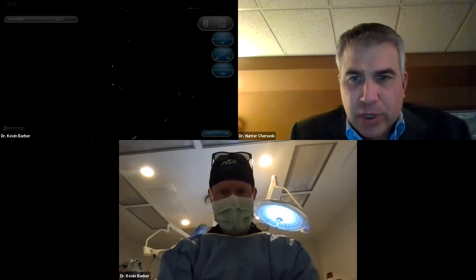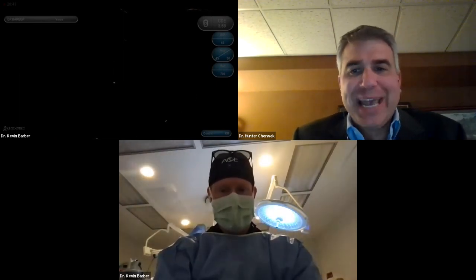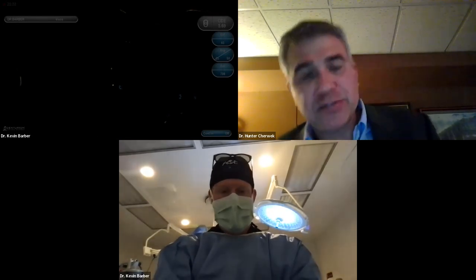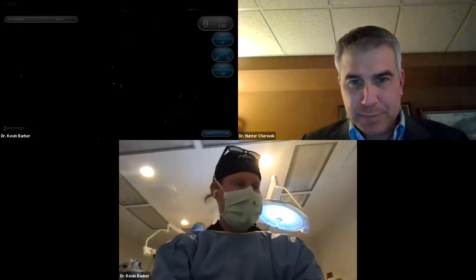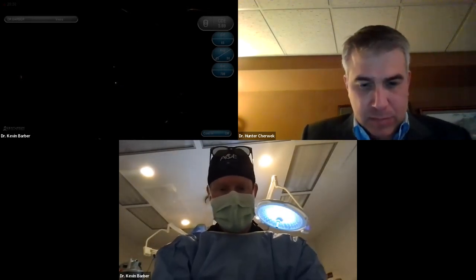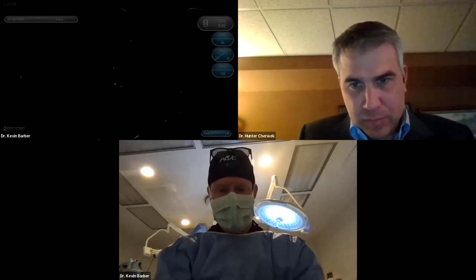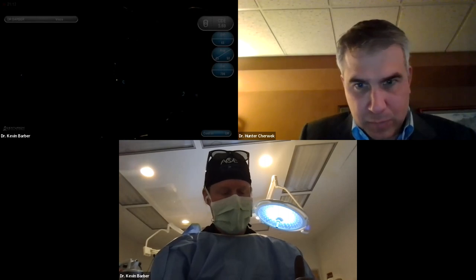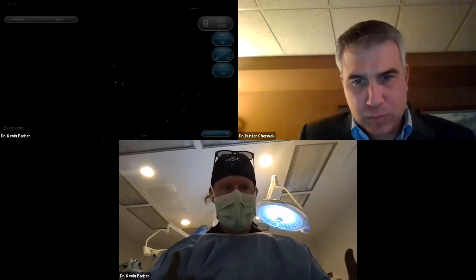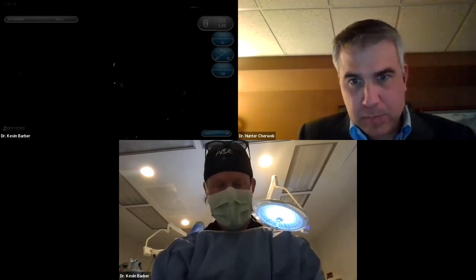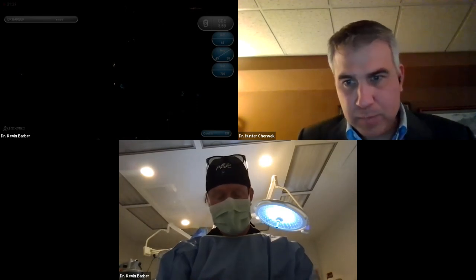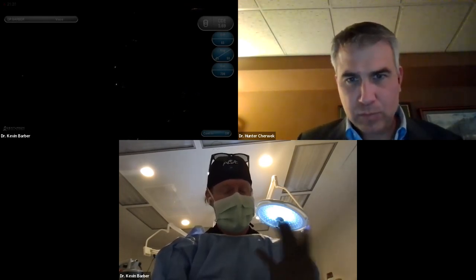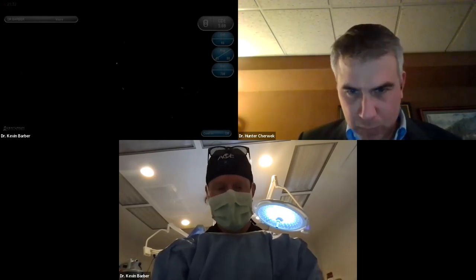Have you ever implanted a single-piece ATIOL in the sulcus? Never. A single-piece lens is not designed for the sulcus. There's a very high probability of UGH syndrome. Those haptics are designed to have friction against the capsule to prevent rotation — without a capsule, they'll rotate and move. Highly discourage putting any single-piece lens in the sulcus, especially an advanced technology lens. If you have capsular compromise, go with a three-piece lens — something more stable for the sulcus if you have to place a lens there.